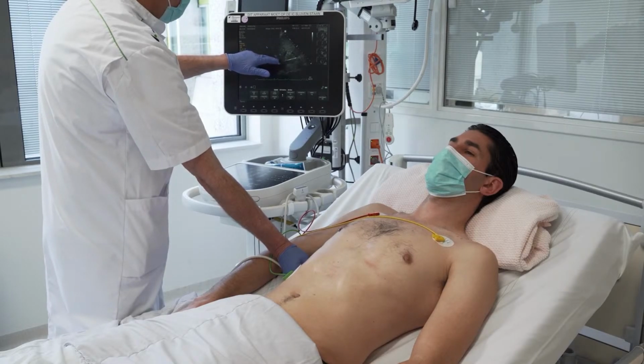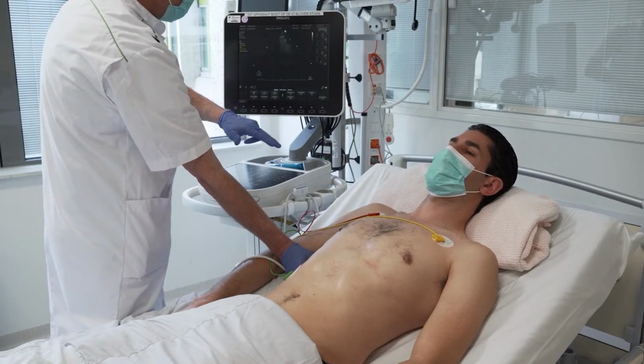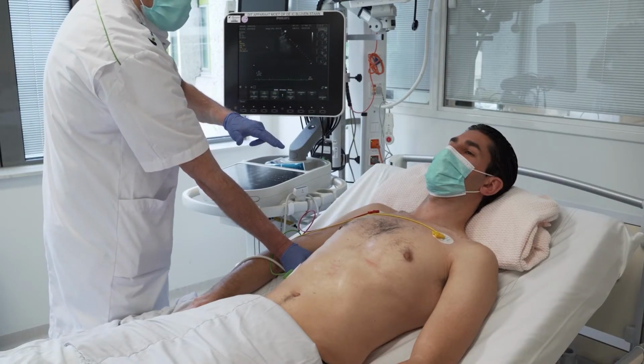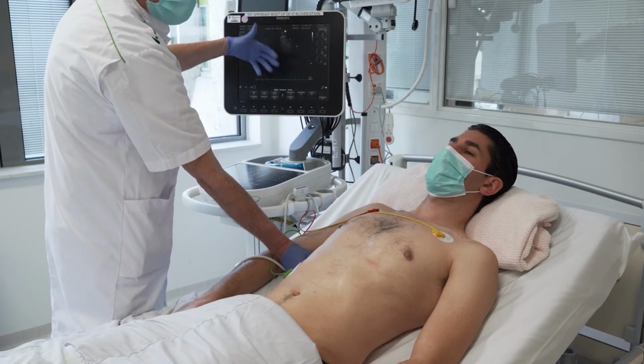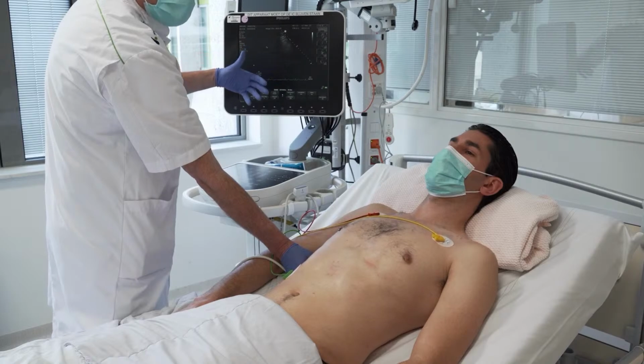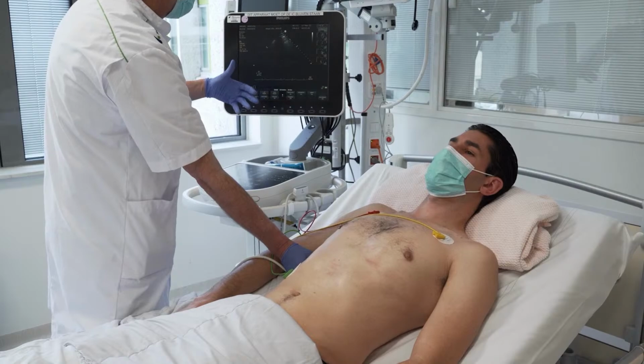Now if I move the probe cranially, I see nothing because this is a healthy patient. But if patient has a hemothorax in a trauma, you will see pleural effusion, and usually you will see a compression atelectasis of the right lower segment.